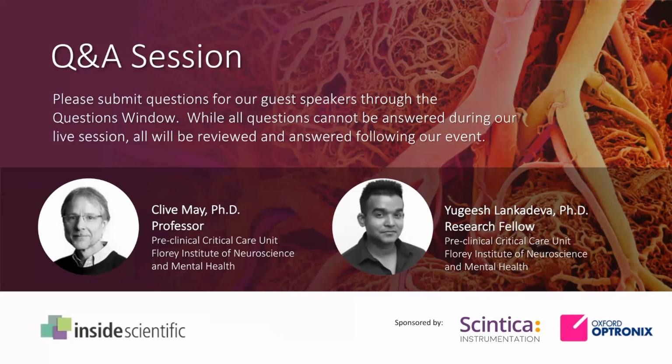But absolutely yes, and I believe that Professor May and Dr. Lankadeva, both of you presented some slides describing the use of our sensors in the brain. Is that right? Yeah, we've been using it in a sheep model of myocardial infarction, in which we've been monitoring cerebral perfusion and oxygenation. As we mentioned in the webinar, if we put the probes in very acutely, they don't give what we think are correct results, but once we've had them implanted for a day or two, they give excellent readings, which correspond very much with other measures we have.